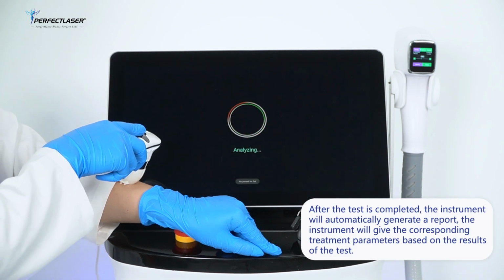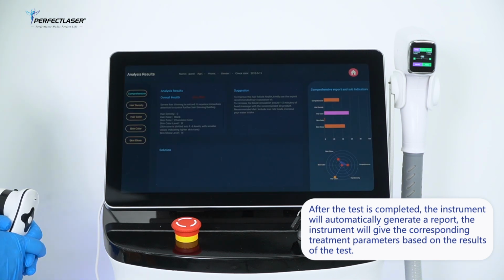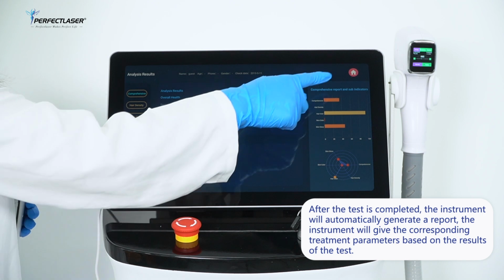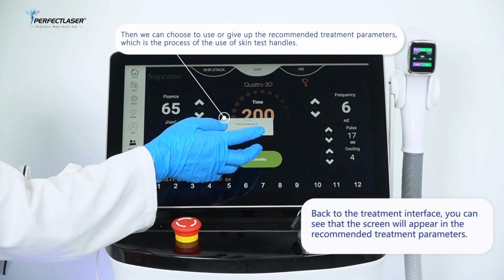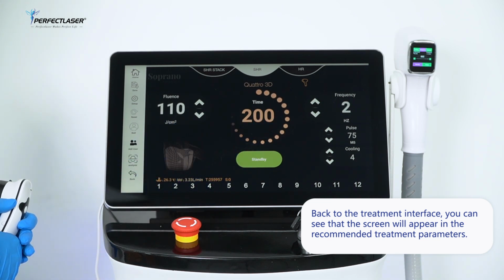After the completion of the test, the instrument will automatically generate a report. The instrument will give corresponding treatment parameters according to the test results of the treatment area. Click to exit the test interface. After returning to the treatment interface, you can see that the recommended treatment parameters will appear on the screen. You can choose to use or abandon the recommended treatment parameters.